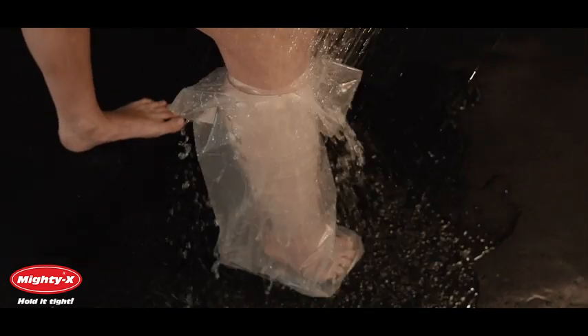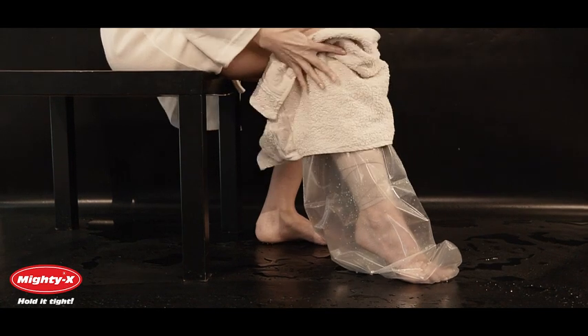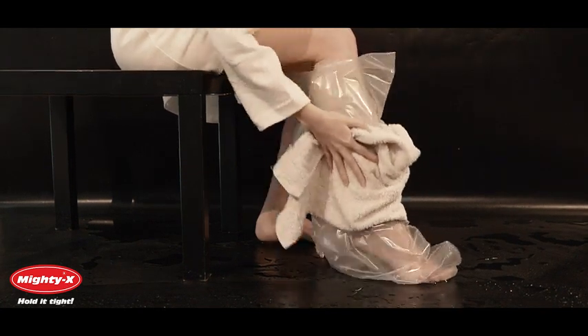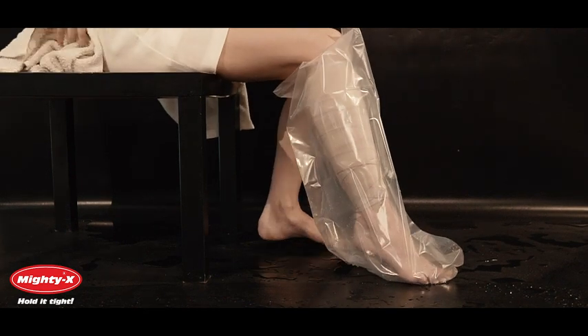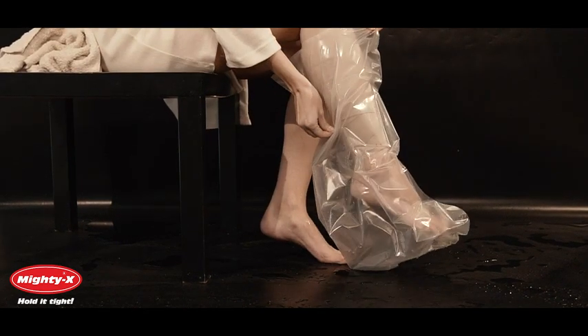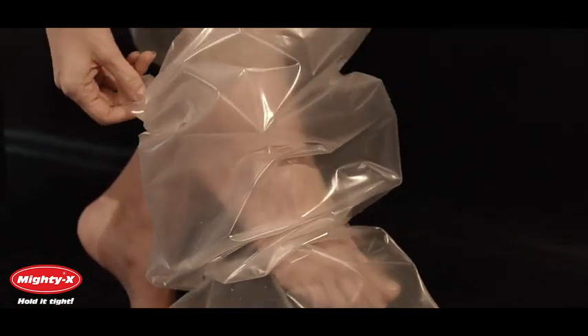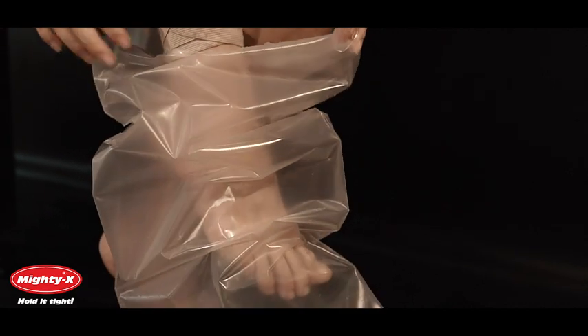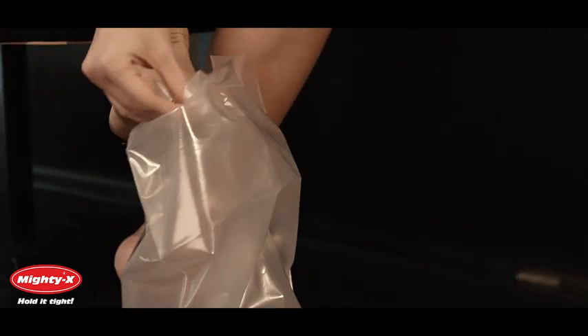You are now ready to shower. In order to get multiple uses out of your leg cast cover, dry it completely with a bath towel and gently pull when removing from the cast. Once removed, lay your leg cast cover flat in a warm, dry place. If you handle your leg cast cover with care, the opening will retain its elasticity. Each cover can withstand many showers, but discontinue use if it becomes too loose. Check out our ratings and decide for yourself.